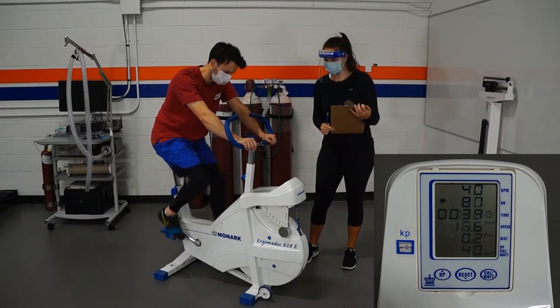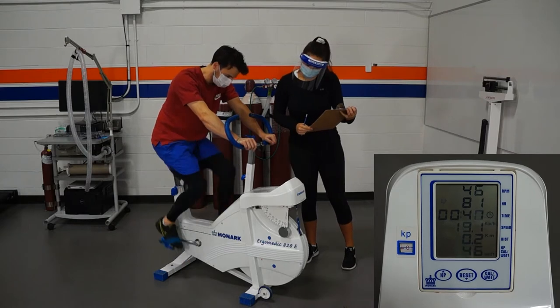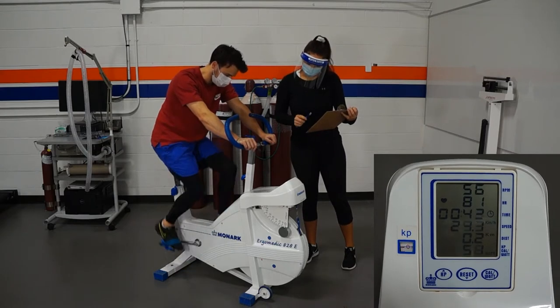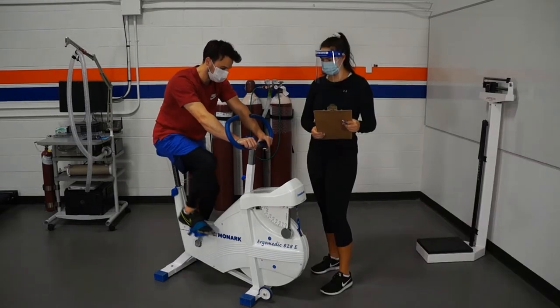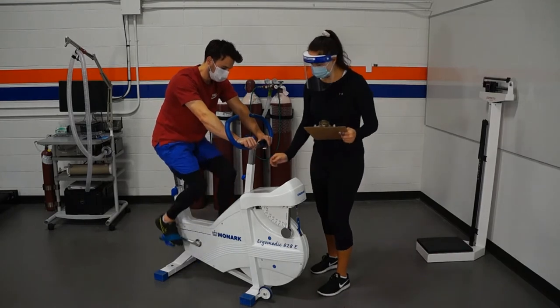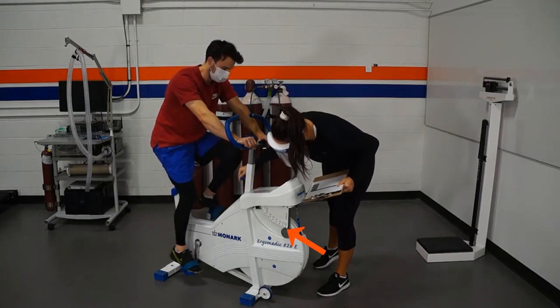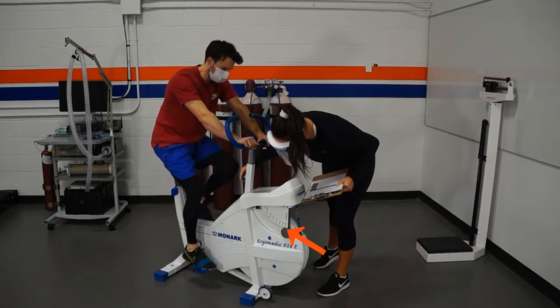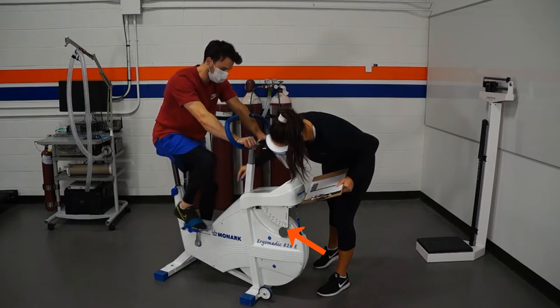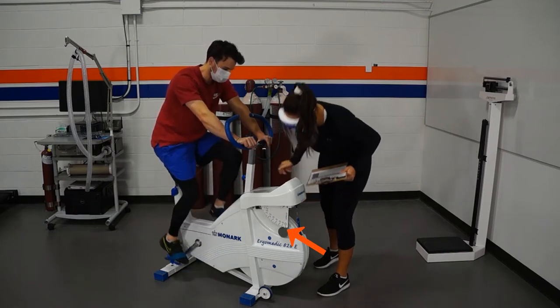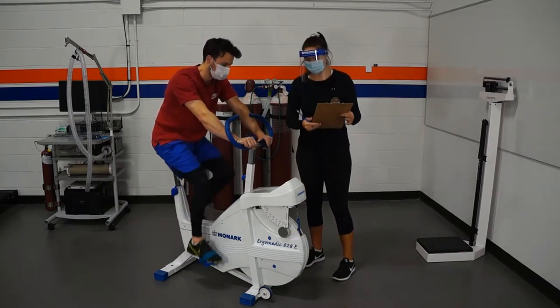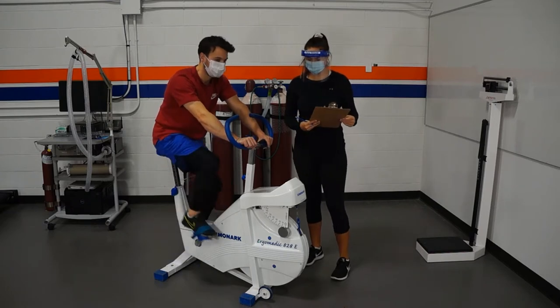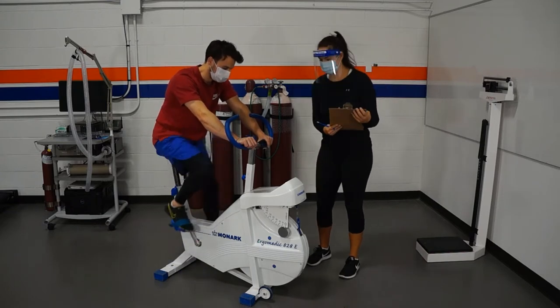Again, getting to that 50 rpm. It is very important that they maintain a steady cadence throughout as to not adjust the workload throughout the test. Once they can maintain that steady cadence, you'll apply the 0.5 kp of resistance to begin the first workload. Now our three minute timer counts and the person pedals throughout the test, taking their heart rate each minute and writing that down.